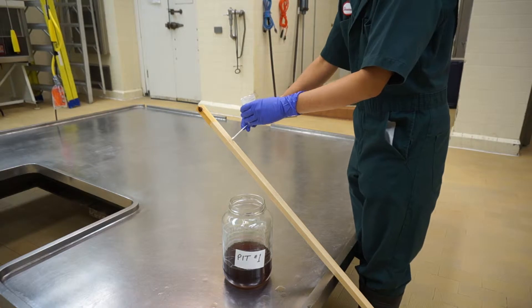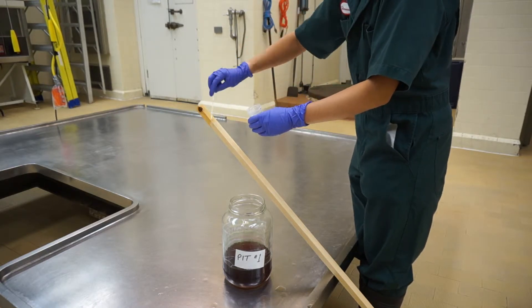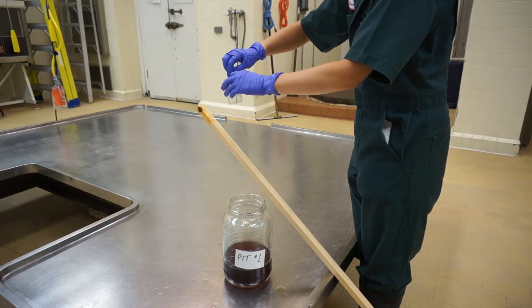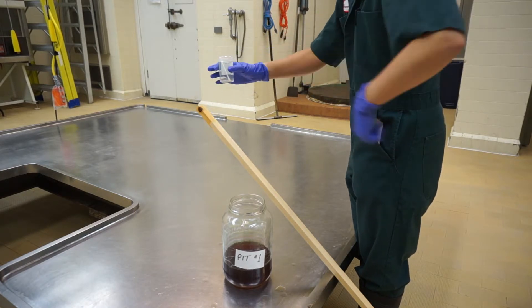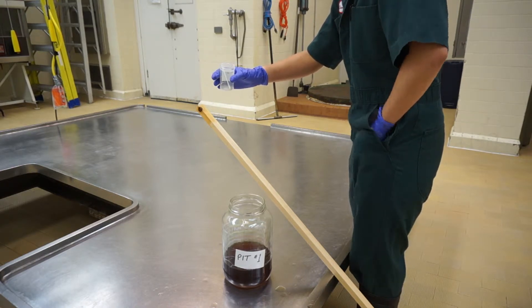Swab enough manure off the stick to coat the entire polyester tip of the swab. Break the swab stem so that the manure coated end can fit in the container when the lid is on. Place the manure coated end of the swab in the container, reseal the container with the orange lid, and put the container back in your pocket.